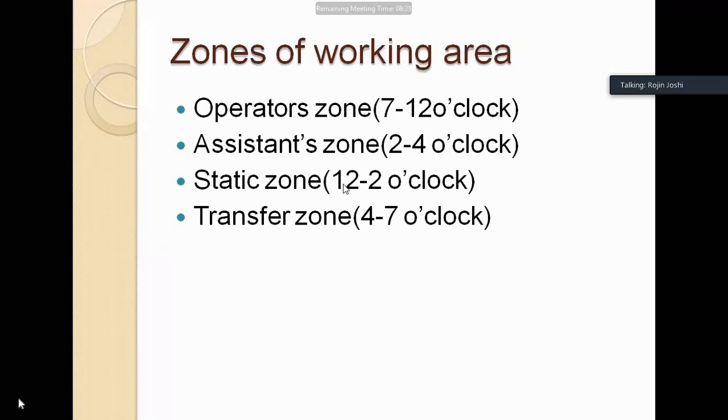Static zone. 12 o'clock to 2 o'clock position is static zone. That is the free zone. Okay, from 12 o'clock to 2 o'clock position, no operations will take place. Transfer zone. Transfer zone is from 4 o'clock to 7 o'clock position. That is, in this transfer zone, we can transfer instruments. The assistant can give you the instruments from the transfer zone.